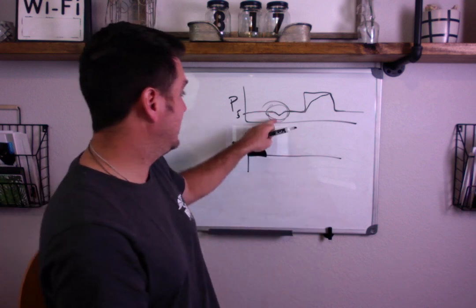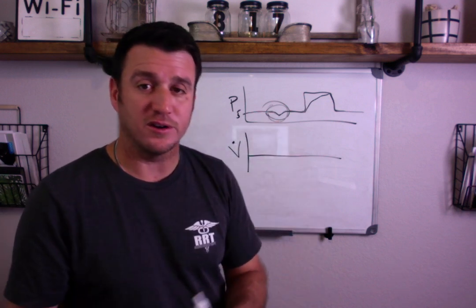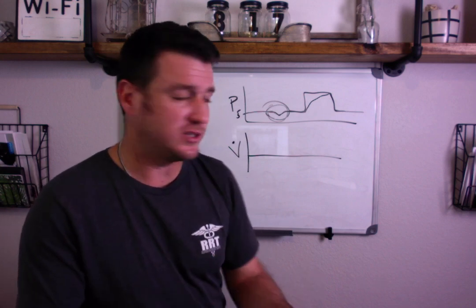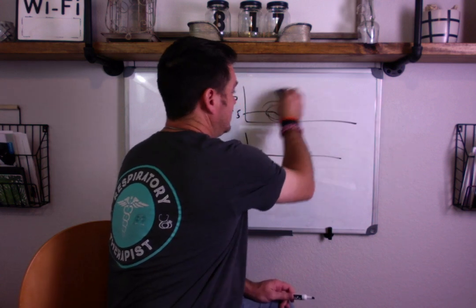So this here is an example of a failure to trigger a breath, and you need to adjust your sensitivity. Okay, now I'm going to erase this.